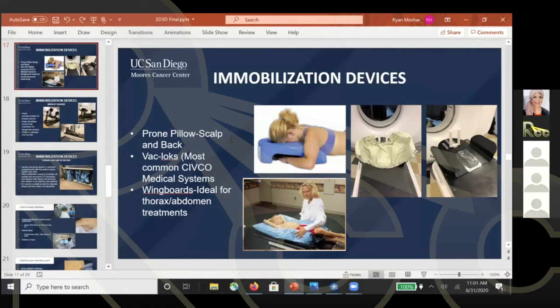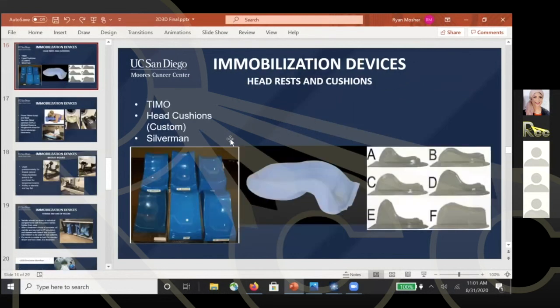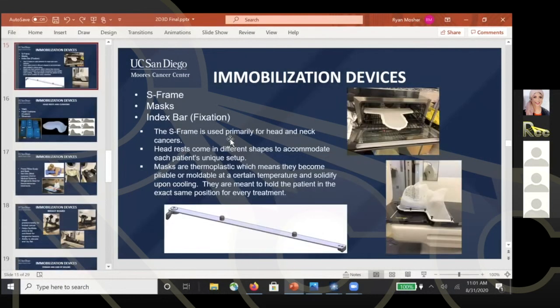They'll just take up much less of the mask. I used to work at a pediatric cancer center for 12 years, and we have our own masks with the small sizes. Oh, really? Wow. Yeah, I'm sure they make them. We're at UCSD. We just use one size, but if you can find children's sizes, that's very helpful.